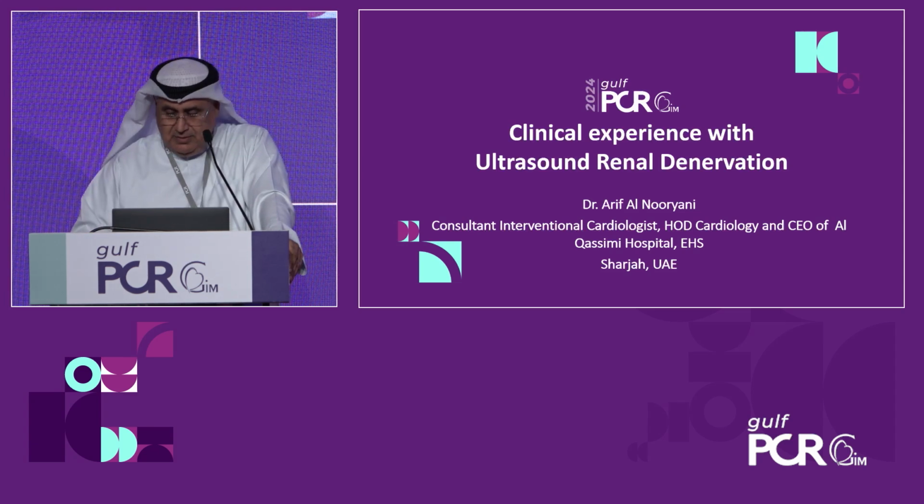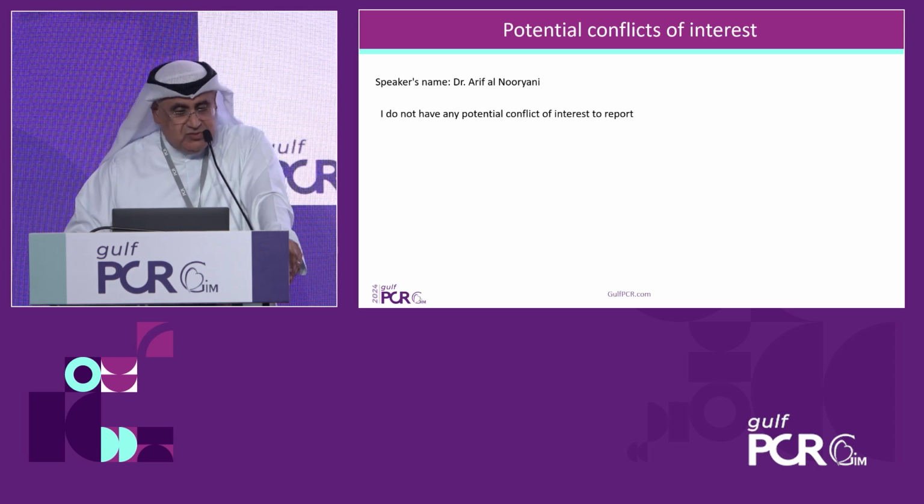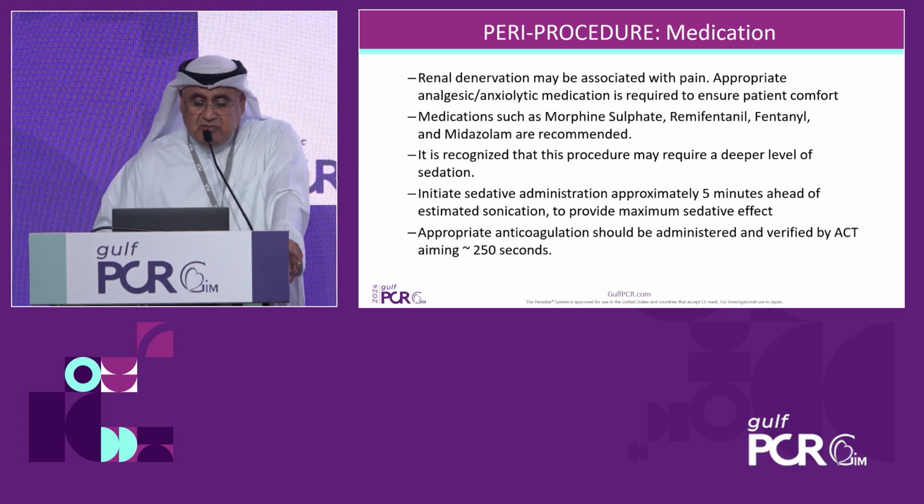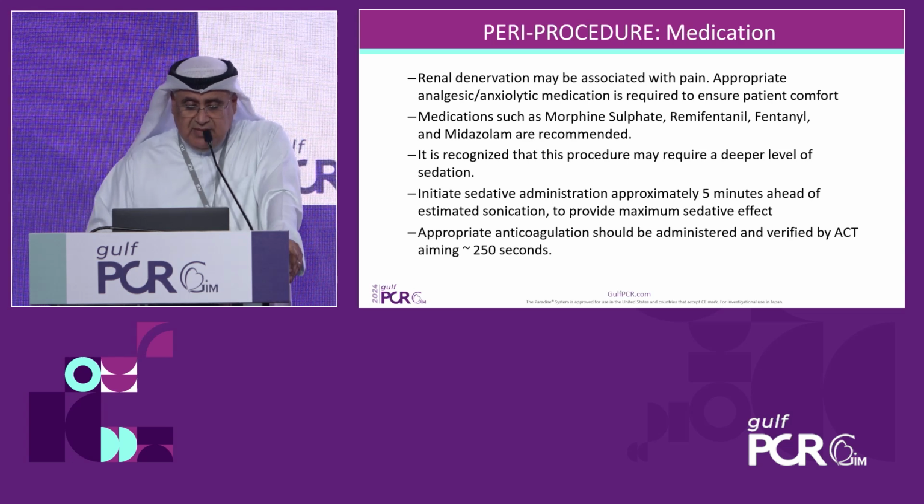I have no conflict of interest. So basically, the pre-procedural medication has already been pointed out by our colleagues: this kind of renal denervation therapy requires conscious sedation or deep conscious sedation using analgesics and anxiolytic medication.